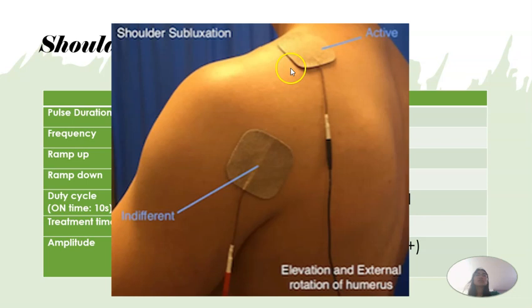Okay? The supraspinatus, no, if there is an option, if nabigyan kayo ng magkaibang size ng electrode, sa amin kasi noon, merong binigay na isang set for large electrode and one set for small electrode, no? If possible, meron din kayong ganon. A large electrode is placed at the supraspinatus and a small electrode is placed at the posterior deltoid. Okay? Para mas ma-stimulate si posterior deltoid.